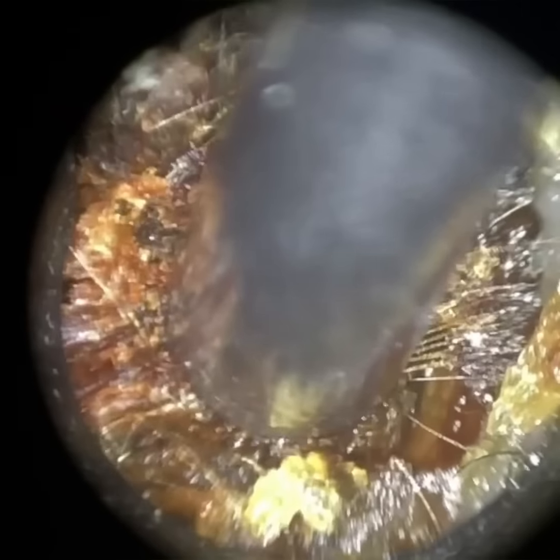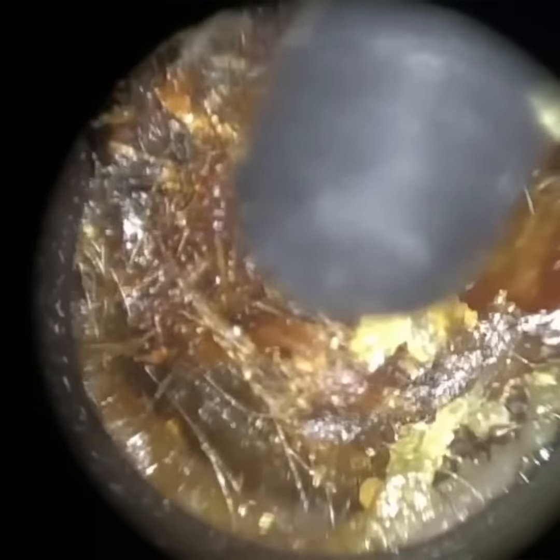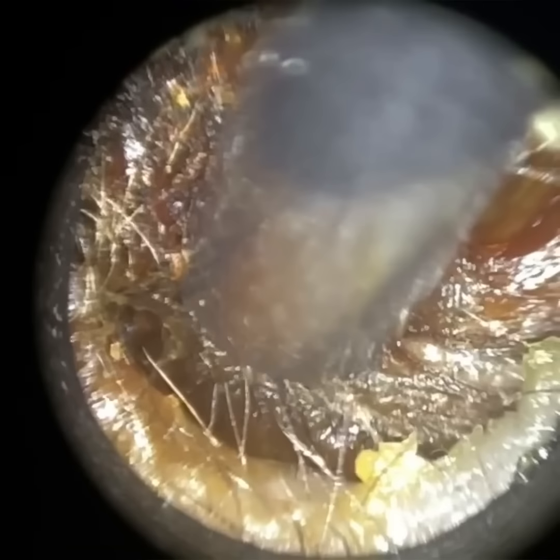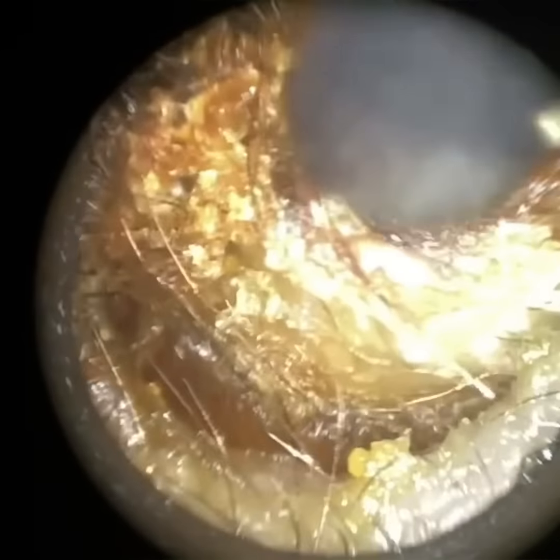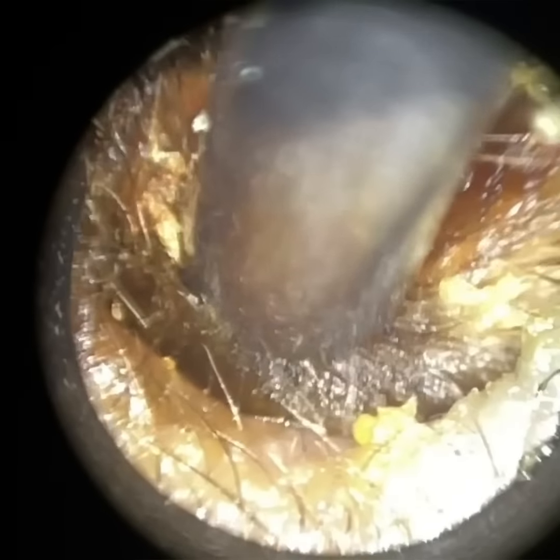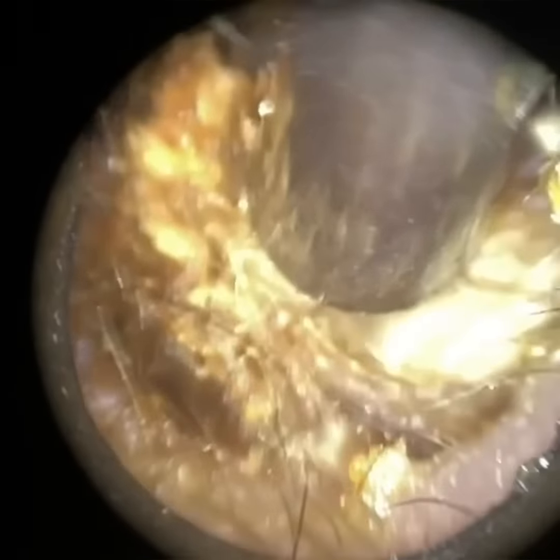And there were elements of Keratosis obturans here because you'll see a bit later on, there was a white peripheral layer of skin, a matrix, which is a hallmark of Keratosis obturans. And the patient themselves did report some otalgia, so earache, which is another hallmark of Keratosis obturans. For anyone who doesn't know what Keratosis obturans is, it's an accumulation of dead skin that forms into a plug in the ear. And this skin plug gets bigger and bigger as more dead skin is shed.